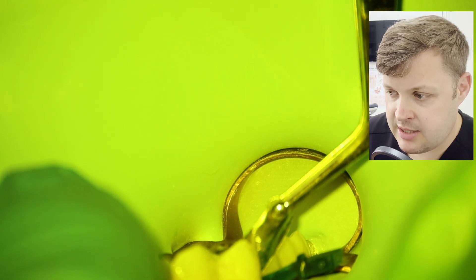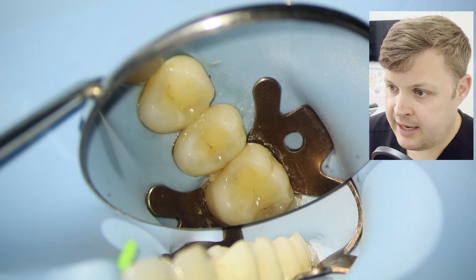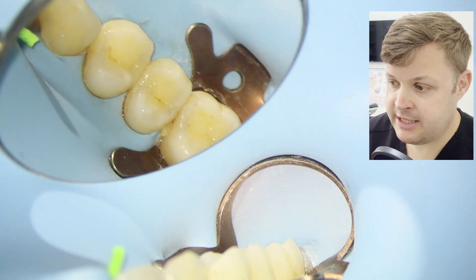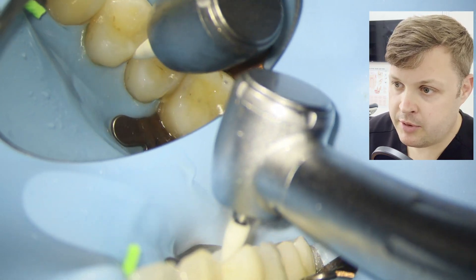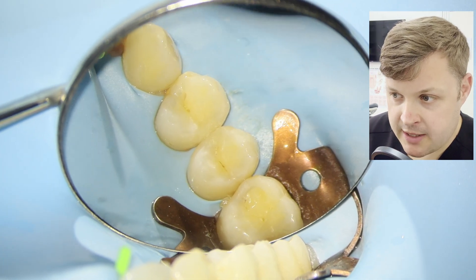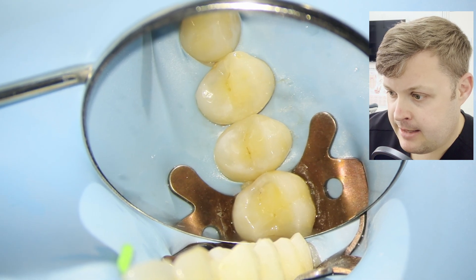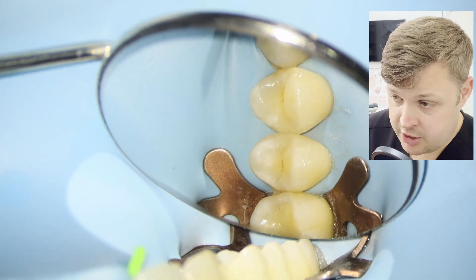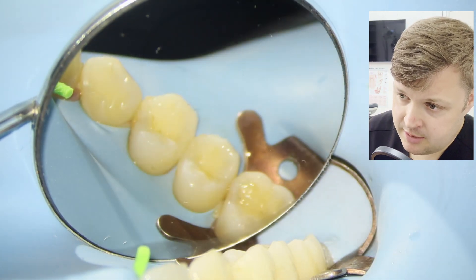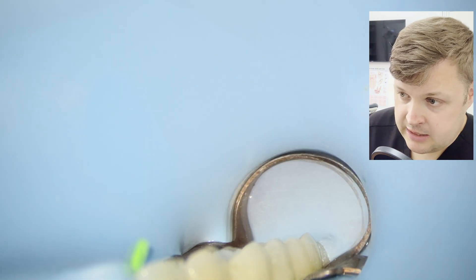We're going to remove the clamp, wedge, and sectional matrix, then light cure for a little longer than usual. We inspect the tooth and overall it's a really nice result — a great contact point. We're just removing some flash and the color match is really nice.